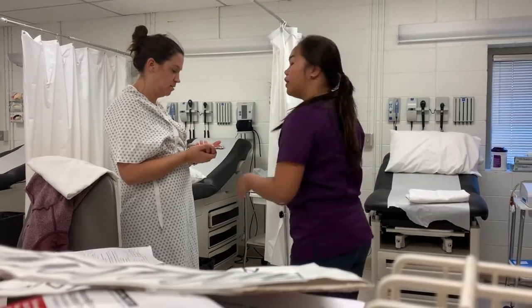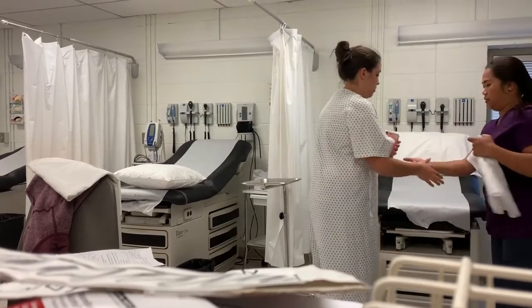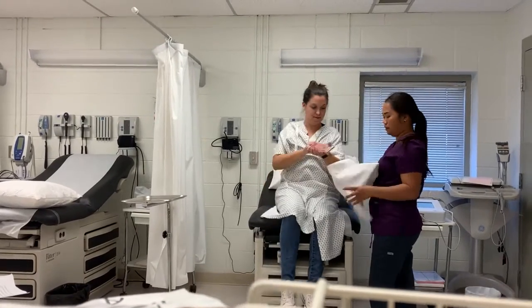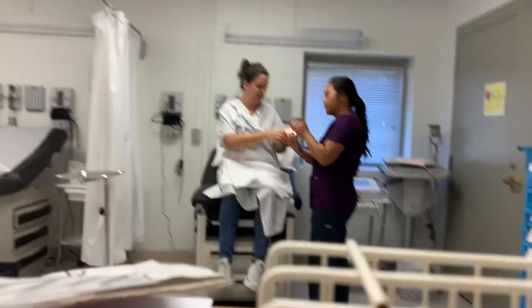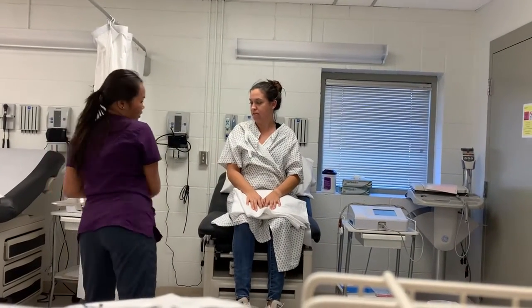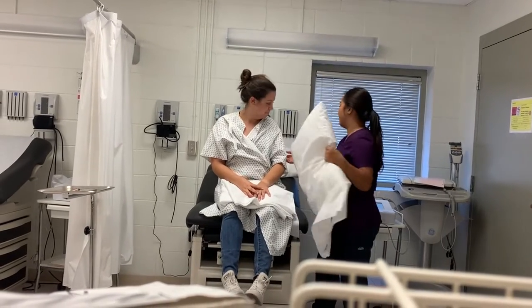Yes. Okay, I'm going to go ahead and help my patient up onto the bed. Do you have any electronics with you? I have all these. Okay, so I'm going to take the cell phone and the smartwatch and place them here so she can see where they are. There you go.